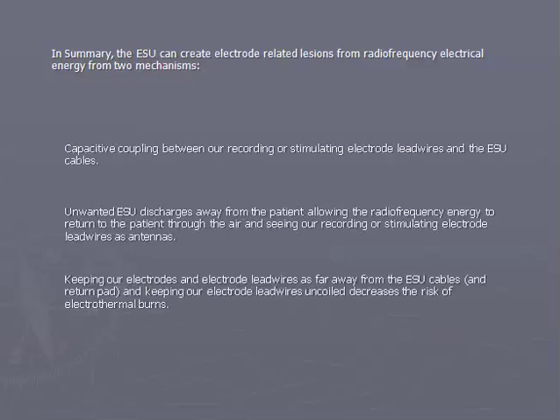Keeping our electrodes and electrode lead wires as far away from the ESU cables and return pad and keeping our electrode lead wires uncoiled decreases the risk of electrothermal burns.